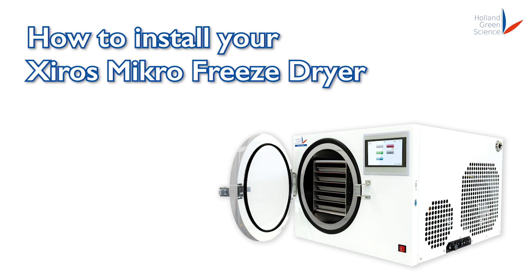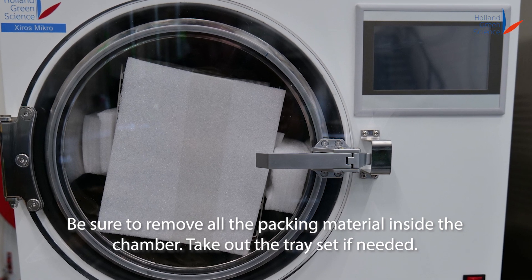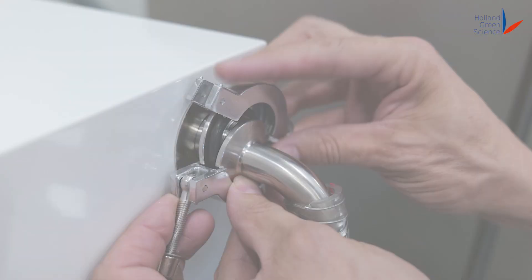How to install your Xiros Mikro Freeze Dryer. Be sure to remove all the packing material inside the chamber. Take out the tray set if needed.